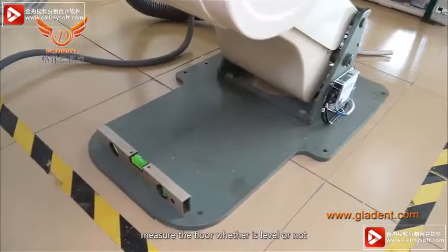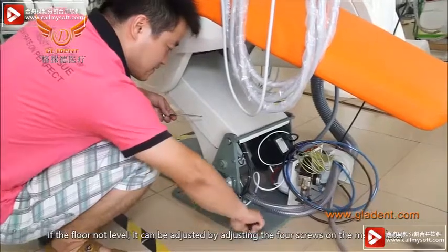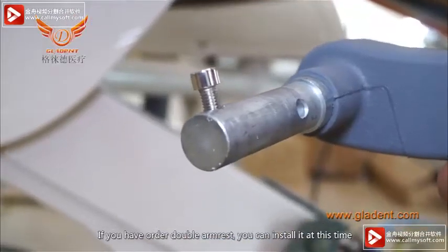Measure the floor to check whether it is level or not. If the floor is not level, it can be adjusted by adjusting the four screws on the metal plate. If you have ordered a double armrest, you can install it at this time.